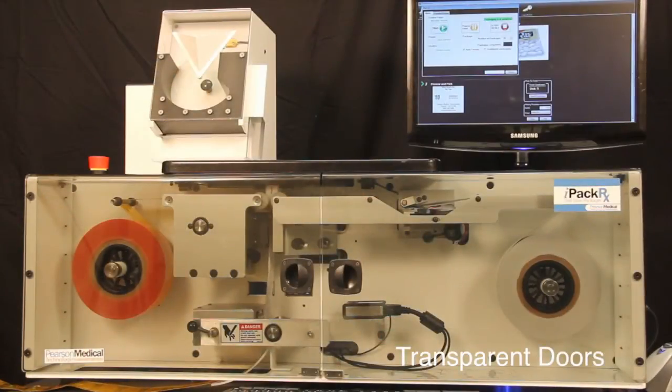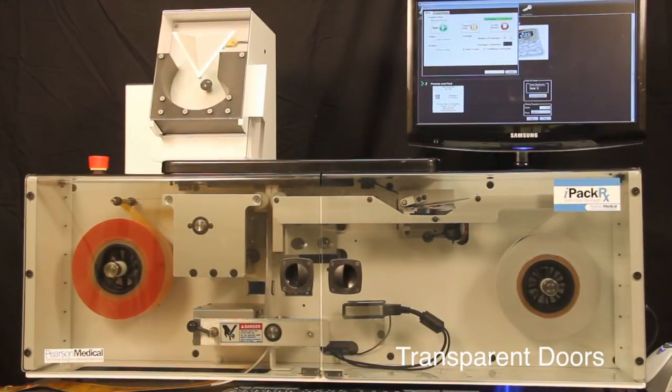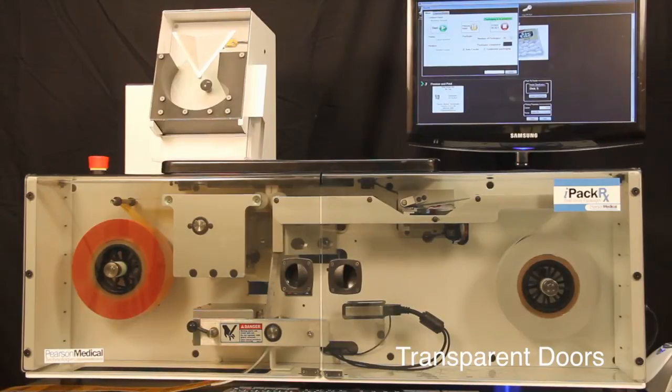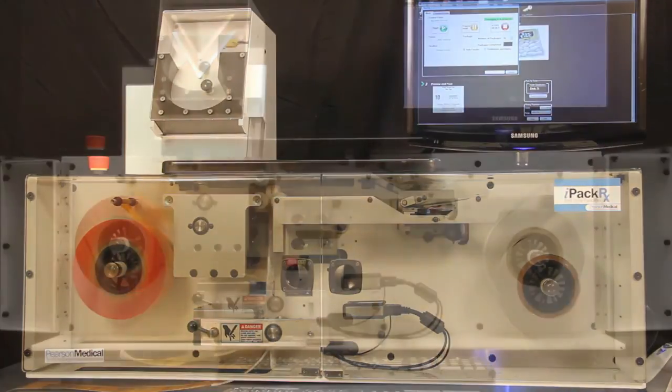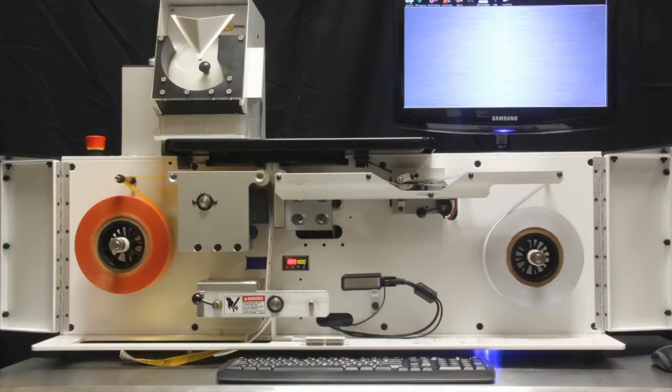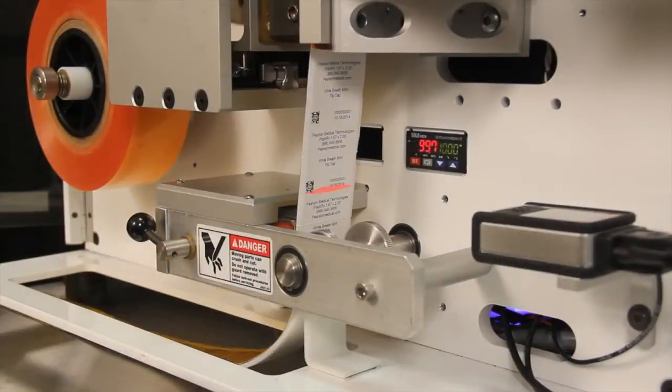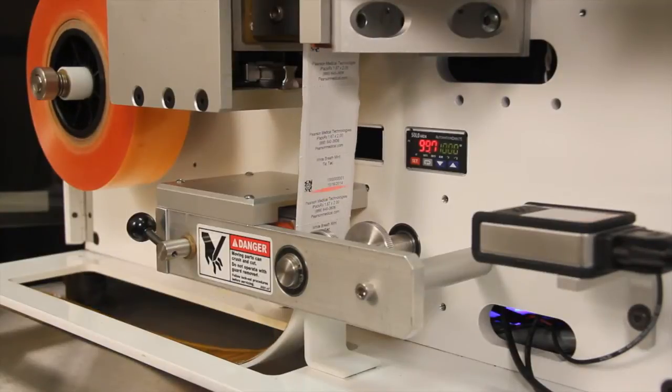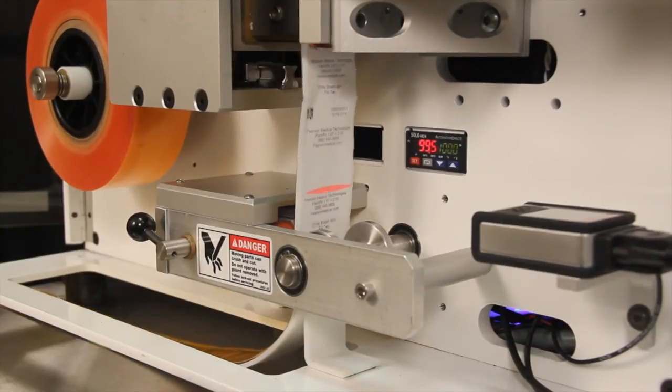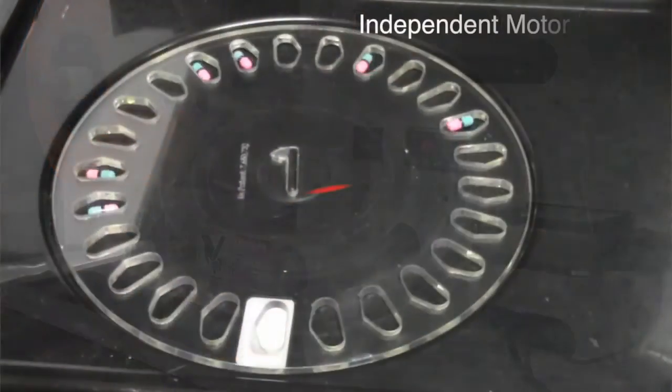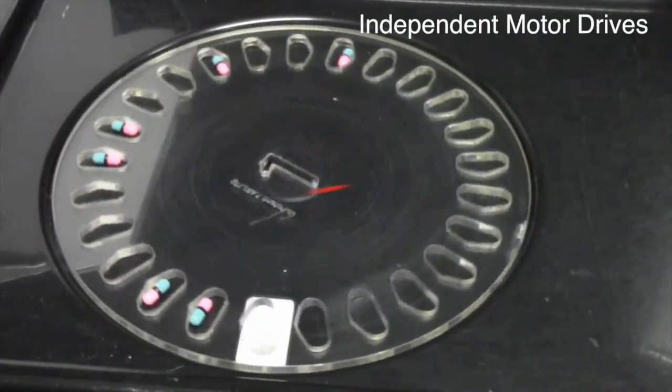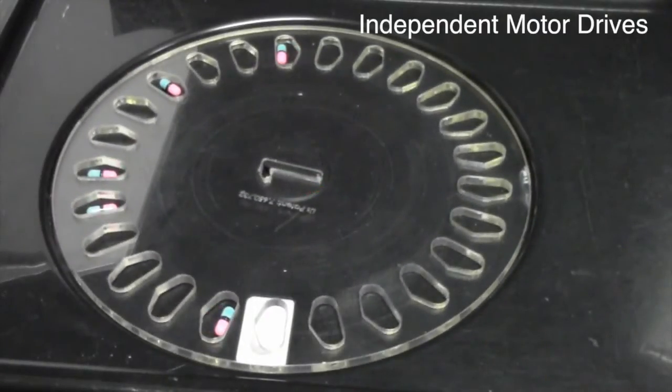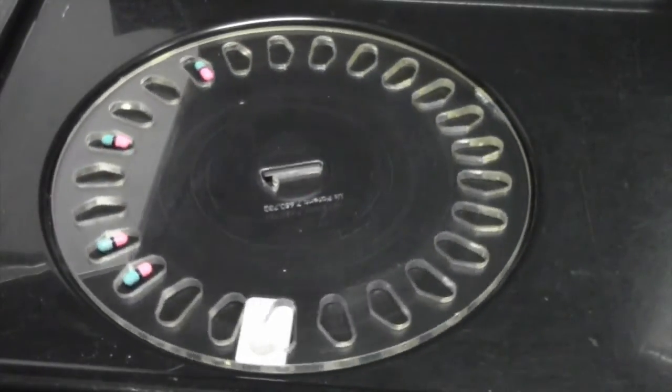Transparent doors safely enclose all packaging operations and halt packaging operations when opened. The doors swing completely out of the way to allow access for easy material loading and cleaning. The use of a direct thermal printer means no print ribbon is necessary, no running out of ink, and no changing ribbons. Independent motor drives on all moving parts allow for unprecedented flexibility and control in all packaging operations.